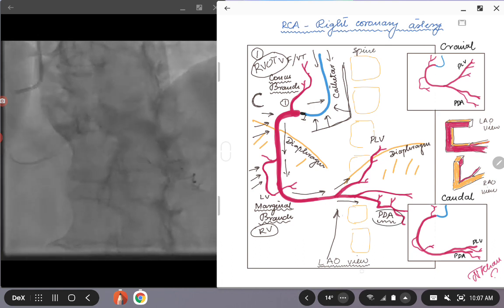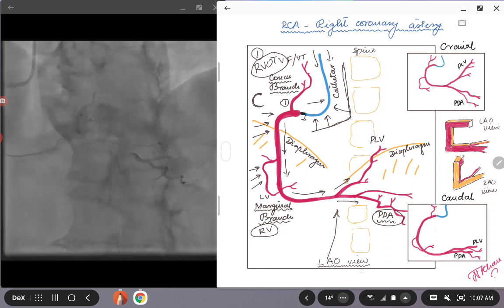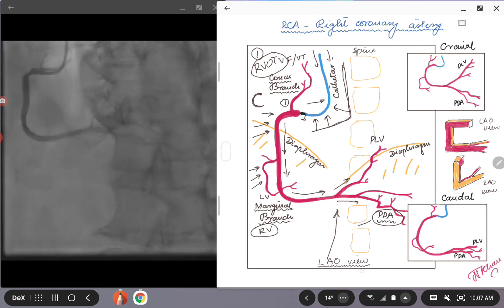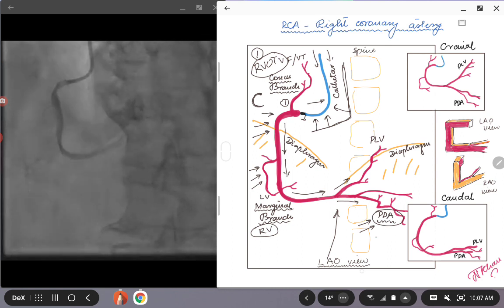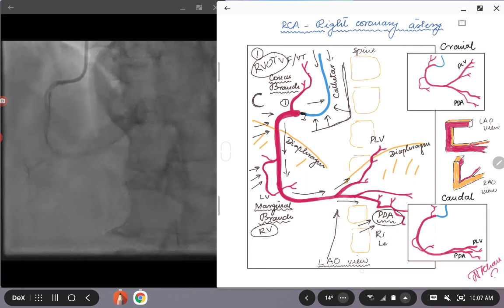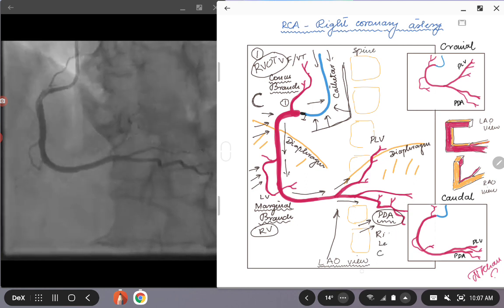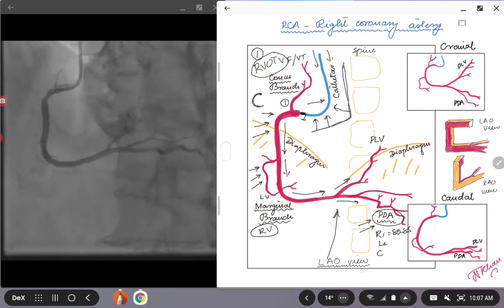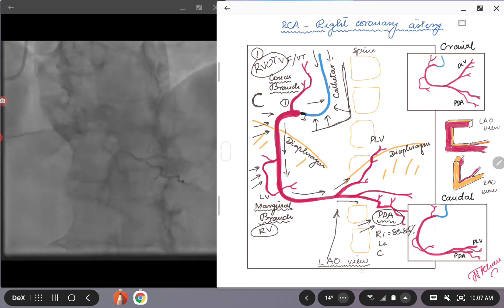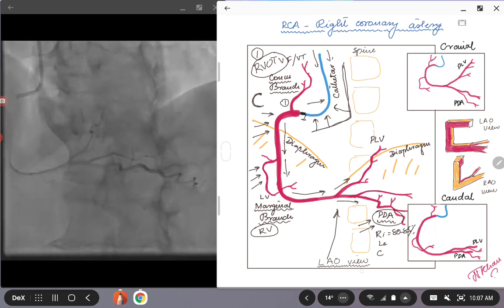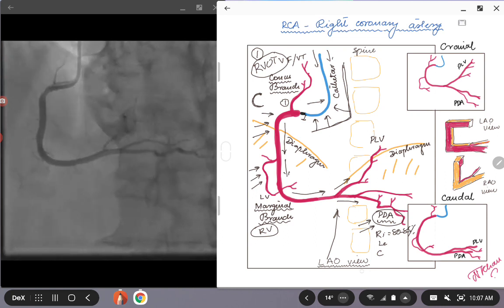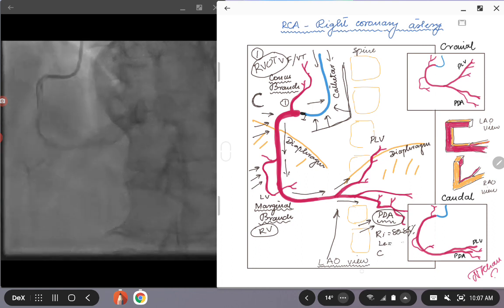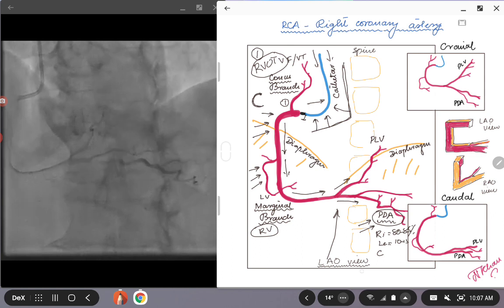Depending on which artery, either the right system or the left system gives the PDA, you'd label the circulation as right dominant, left dominant, or co-dominant. By far, about 80 to 85 percent of the time, the circulation, coronary circulation in patients, is right dominant, meaning the right coronary artery gives the posterior descending artery.